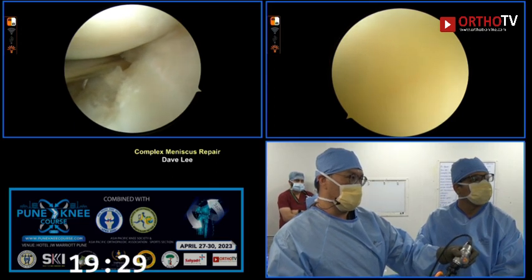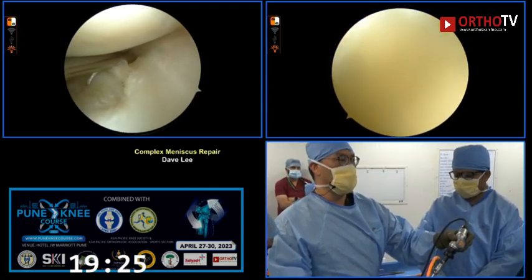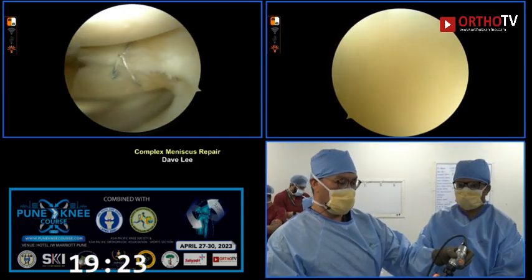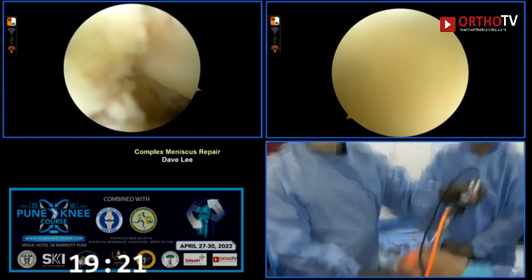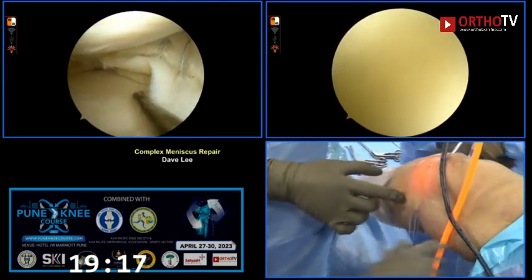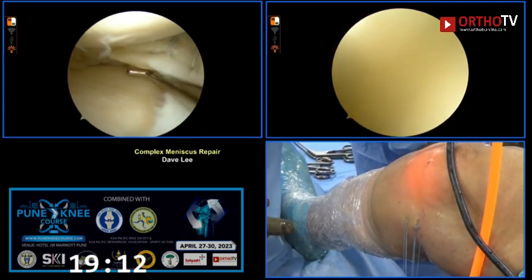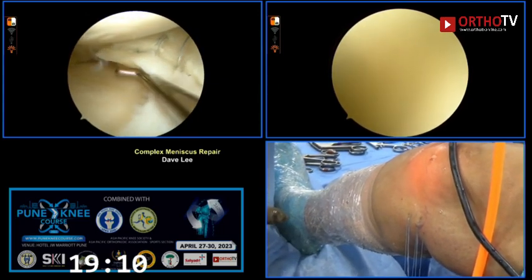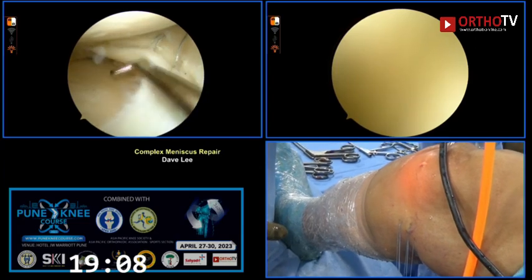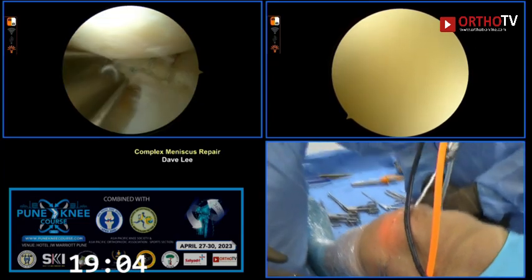I think that as of now we have placed four sutures. And they are curving, and I don't know if the external picture can show, but they are located in this region, and so we just have to dissect it. Then there was this flap, it was just annoying, and I was trying to decide to use a hay bale fashion to just try and capture it.